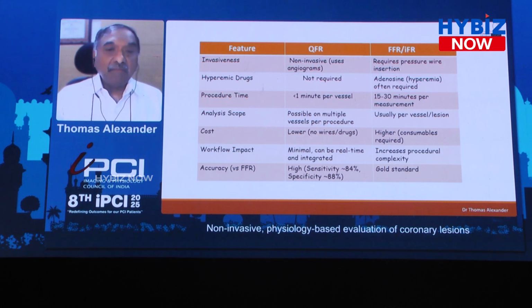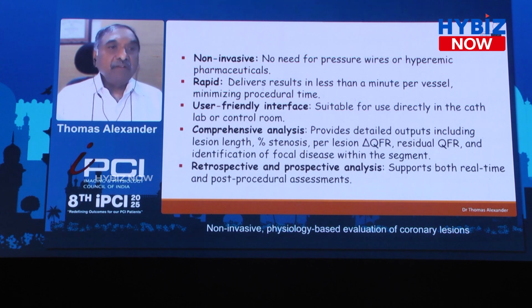And its accuracy, multiple studies have shown that it's as good as FFR and iFR. So it's non-invasive, it's rapid, it's user-friendly, but more than that, I think these are the two important things that we must remember. It does much more than just FFR-like analysis, and I'll show you some of the things that it can do. And importantly, it can be retrospective also.